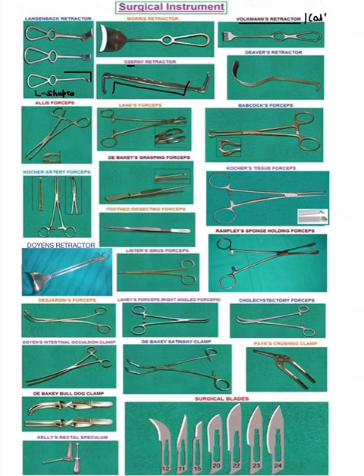This is also known as cat's paw retractor because it looks like the paw of a cat. Then you have a Deaver retractor that is used for liver retraction. This Deaver retractor looks like a D. Then you have an Allis tissue holding forceps. So the ends will have a marking in order to hold the tissue. Then Lane's forceps. It looks like two lanes are there. Two-way pathway. That is the Lane's forceps.